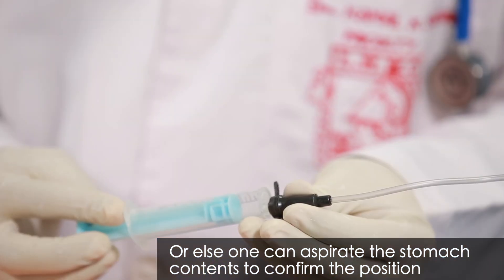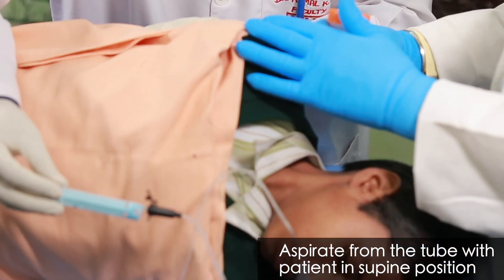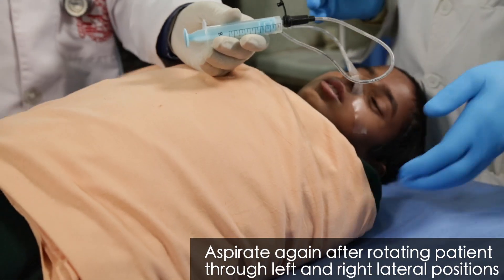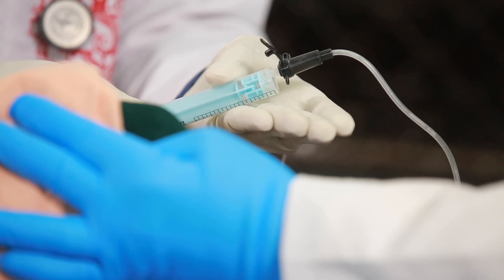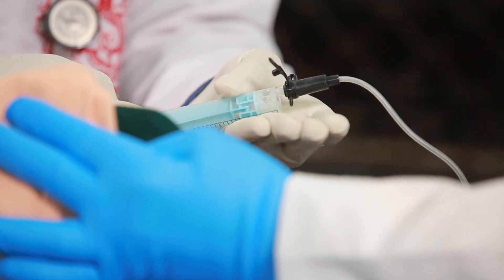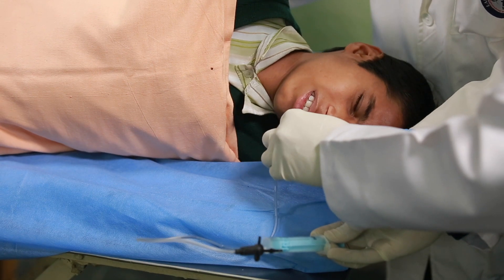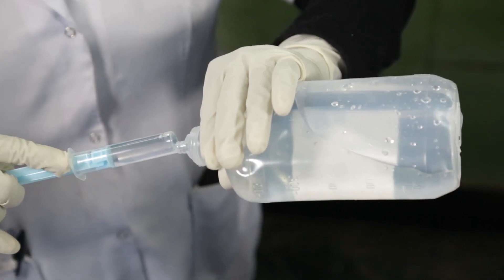Gently aspirate from the tube keeping the patient in the supine position. If there is no aspirate or the quantity is inadequate, try re-aspiration after shifting the patient to the left and right lateral positions. If adequate specimen is still not obtained, further aspiration can be retried by shifting the tube a little in or out in an effort to hit the stomach contents. Repeat aspiration should be done while rotating the patient through supine and lateral positions.